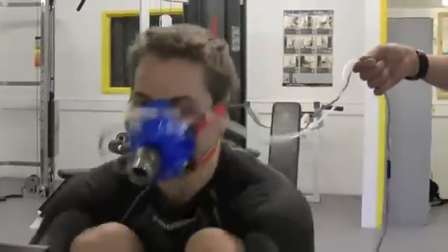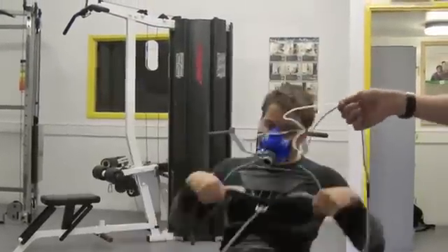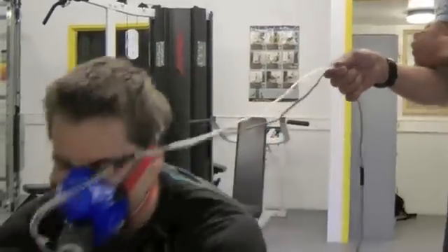Come on, you can do it. Push it out. Keep going — I've got more in you. Push it out. 10 more seconds. Keep going. Come on Maren, you can do it. Keep going, 10 more seconds. Keep going. Come on, that's it. Okay, you're at it now. Good.